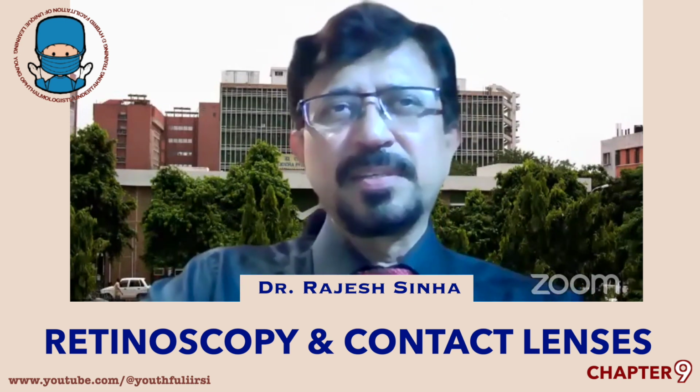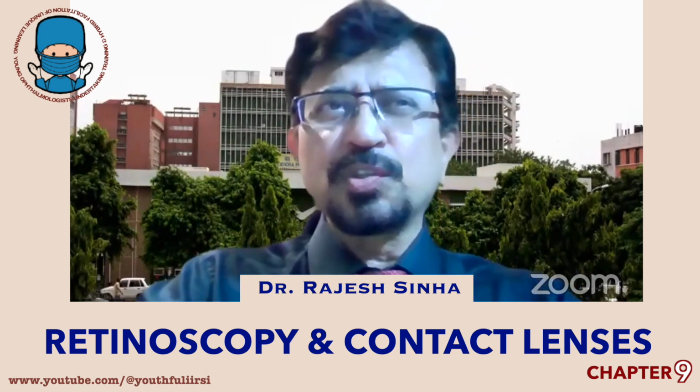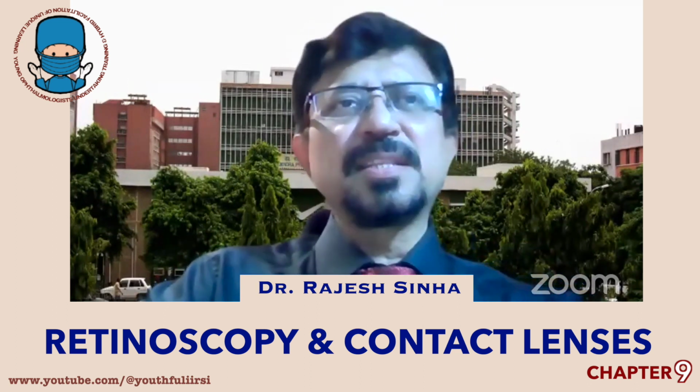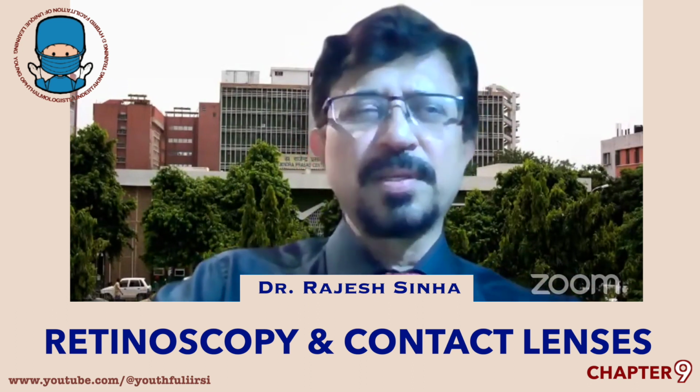There is a subset of patients, I mean, there's no doubt about it, who are not very keen on contact lenses for regular use. So definitely in such cases, orthokeratology does help, and it is quite a useful tool.